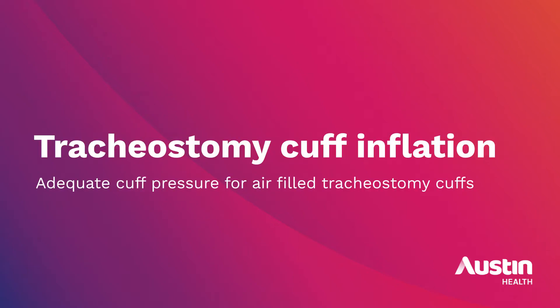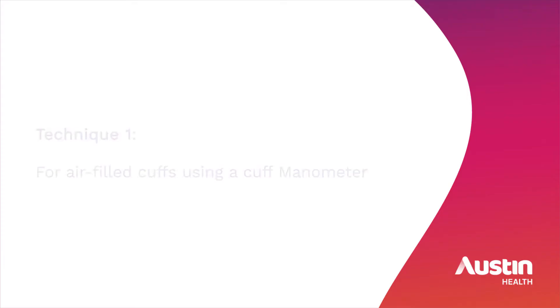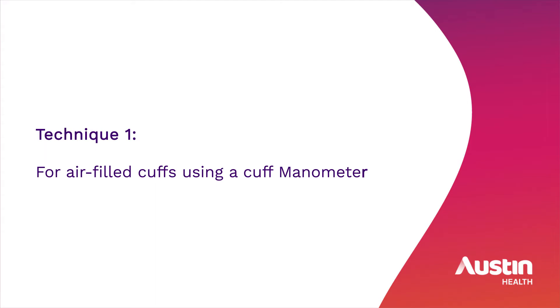In this video we will demonstrate cuff inflation as well as how to ensure adequate cuff pressure for air-filled tracheostomy cuffs. This video should be used in conjunction with the OPIC tracheostomy cuff management clinical procedure. This video demonstrates how to ensure adequate cuff pressure using the cuff manometer and cuff manager devices. Technique 1 for air-filled cuffs using a cuff manometer.